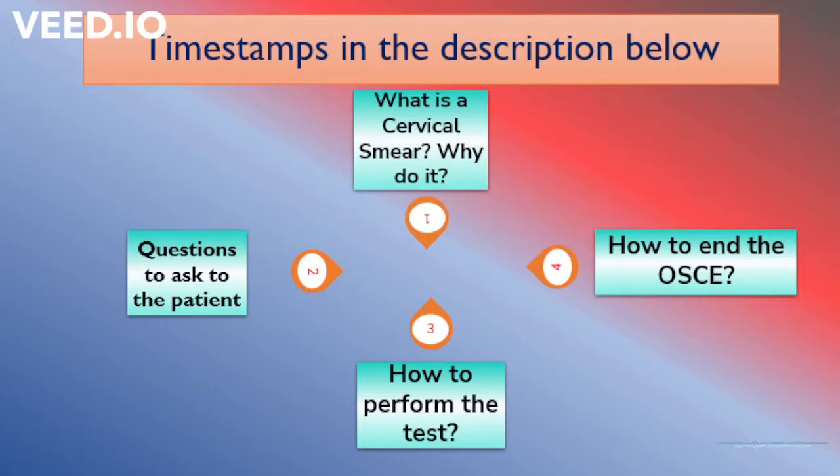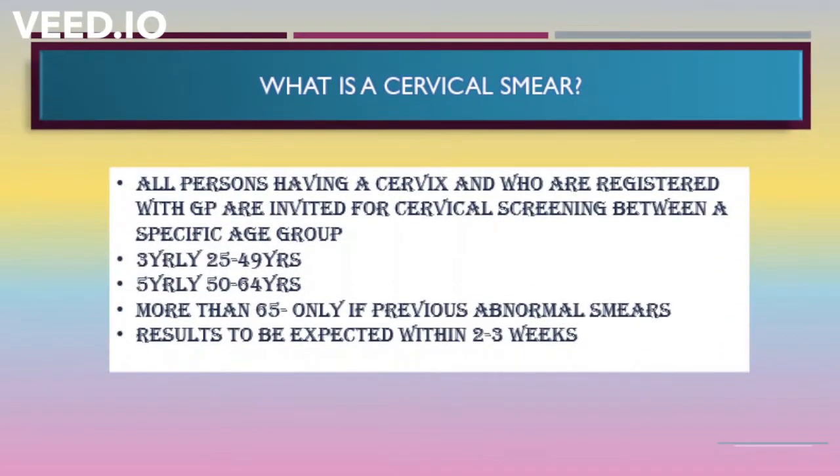Hello everyone. For today's topic, we'll be going according to these main points. We'll be looking at what is a cervical smear, why do we do it, the questions to ask the patient, how to perform the test, as well as how to end the OSCE. What is a cervical smear?